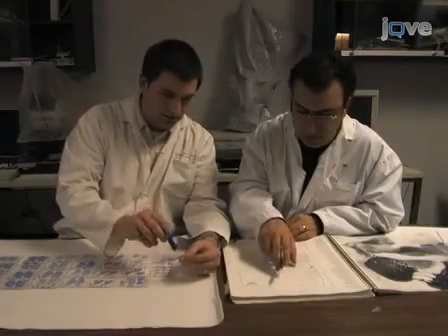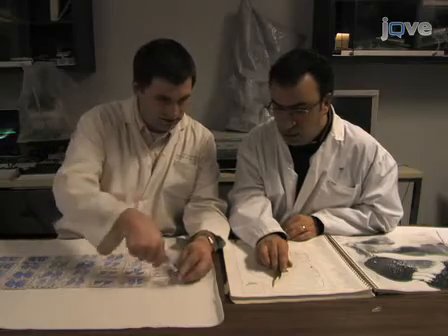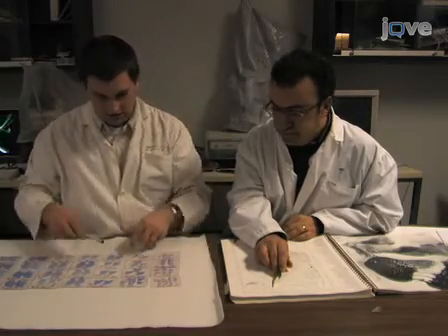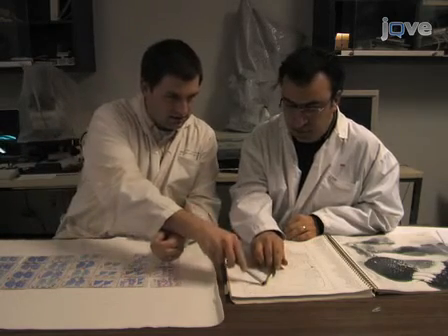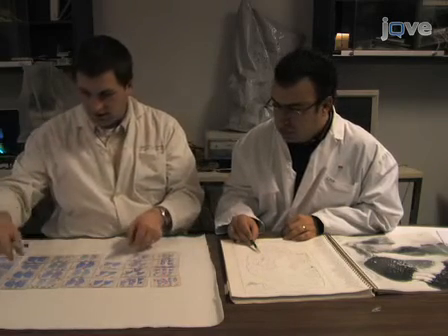To determine the section sampling fraction, the entire reference space must be well defined from anterior to posterior and dorsal to ventral. Here, we are interested in the frontal lobe, which we define as the region from the tip of the frontal pole to the central sulcus and the lateral sulcus, excluding the insula.